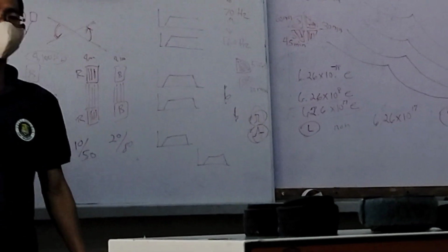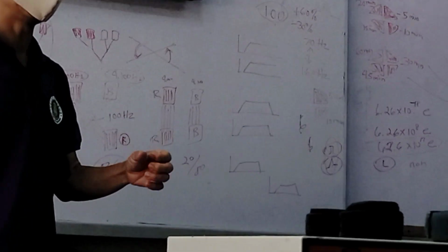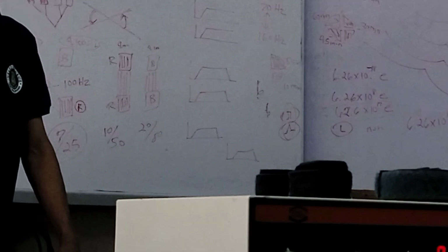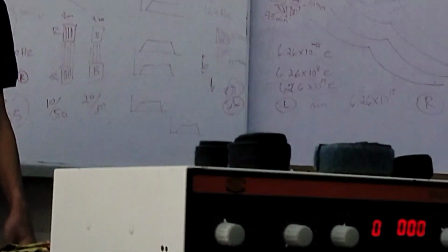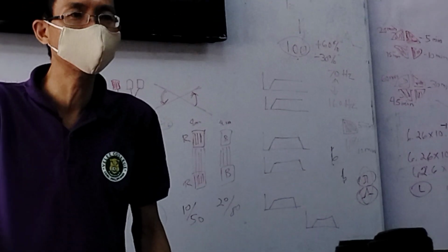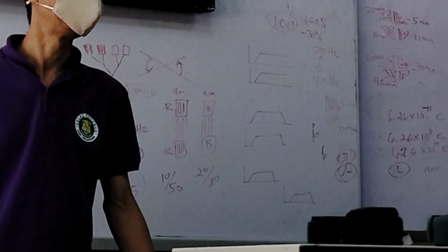This is what we call synchronous contraction. If you're stimulating two muscles, the two muscles will contract at the same time. Same as what we discussed last time in NMES, that synchronous. We mentioned that we apply synchronous for those muscles having the same action, or for those muscles that would produce a certain functional motion. Okay?